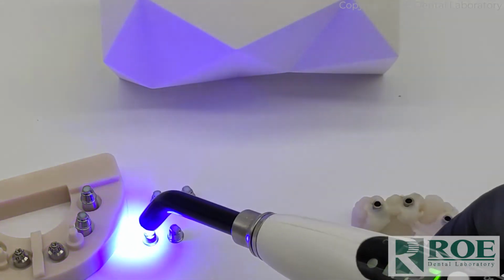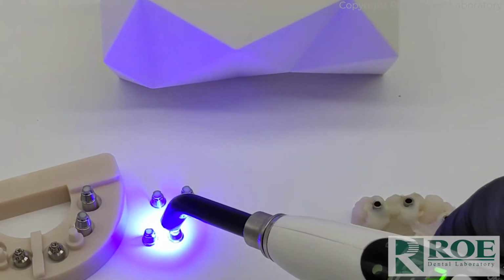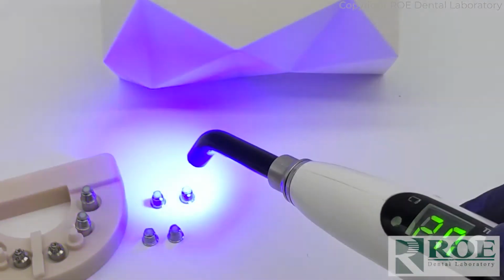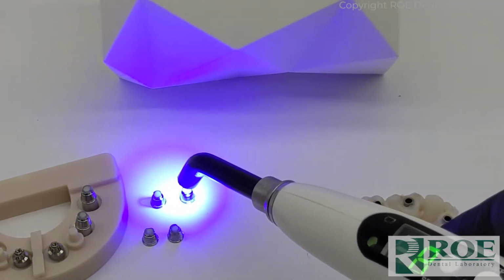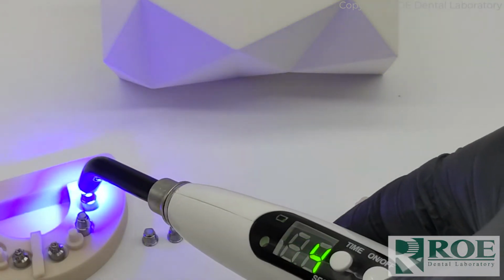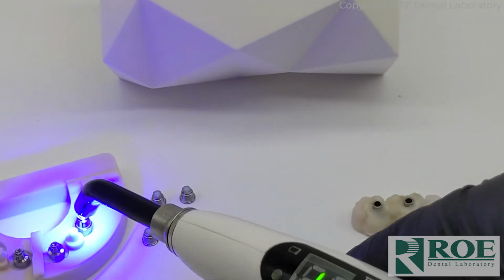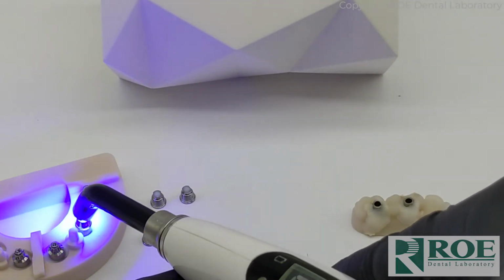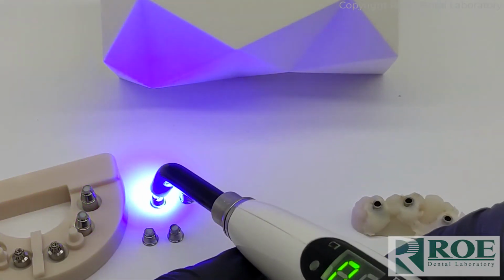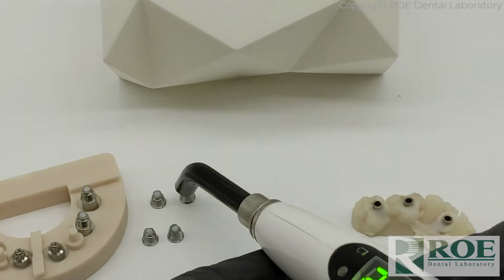The more curing light time that you use, obviously the quicker the process goes, because you can wait 2 minutes or you can wait 20 seconds. Look at me, I'm impatient. It's a 5-second tack, but a 20-second full cure. I don't really need a full cure. I just want to make sure that they don't pop out, so I'm just going to kind of tack them in.